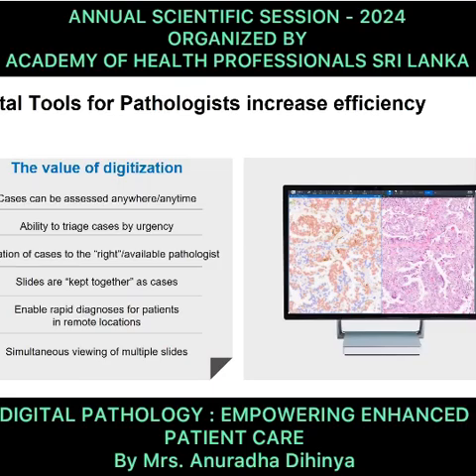But digitally, you can look at H&E slides and other IHC or special stain markers. So 6 slides or 8 slides can be looked at the same time.